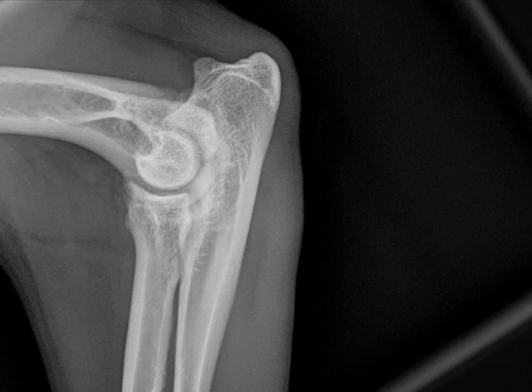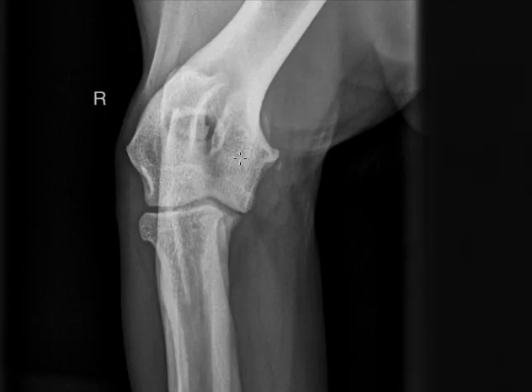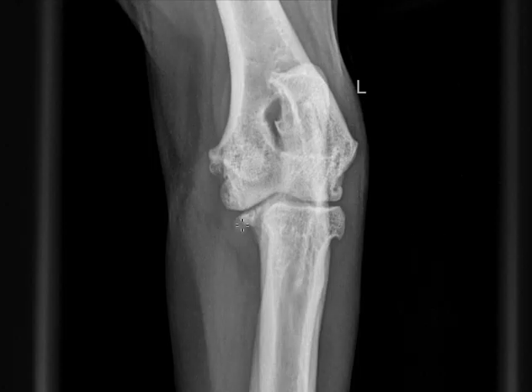So, taken together, these findings are consistent with bilateral elbow dysplasia, substantially more apparent on the left side, and especially of concern, going back to the left elbow, is this medial coronoid process. Be sure to review the full report associated with this case.